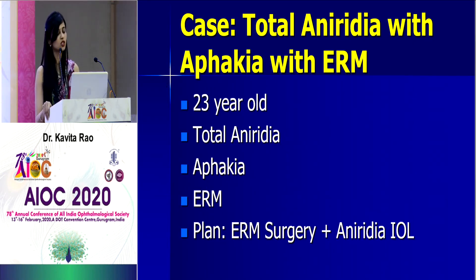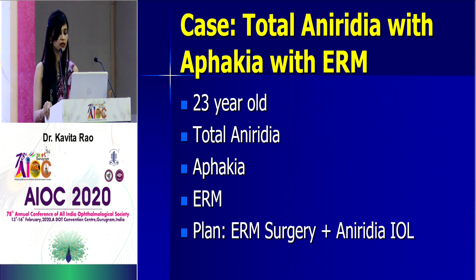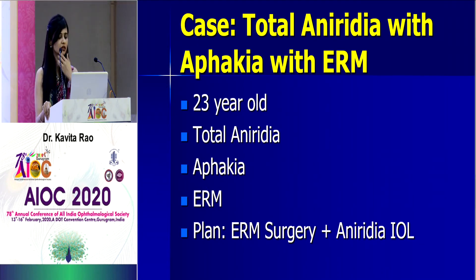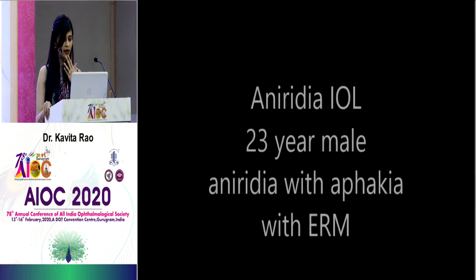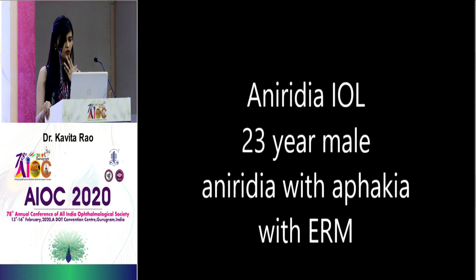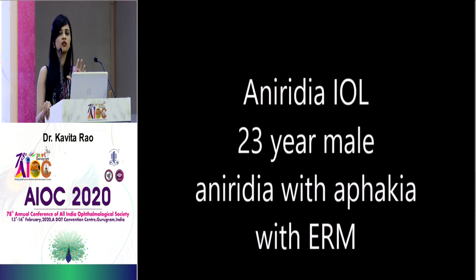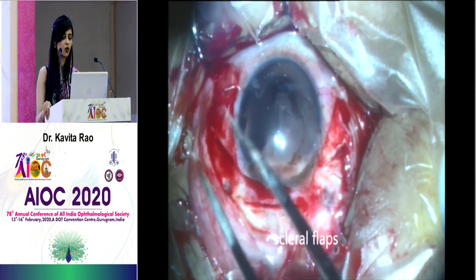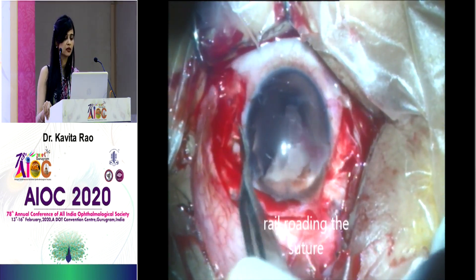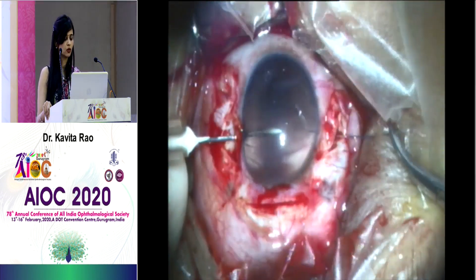The next patient came with complete total aniridia and aphakia. He had been operated elsewhere and now has an ERM. We decided to put in an aniridia IOL, which has an IOL in the center and an iris component — available in two colors, custom made. Again, I used the railroading technique for the suture.